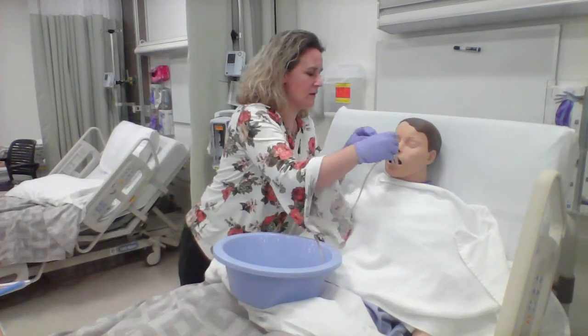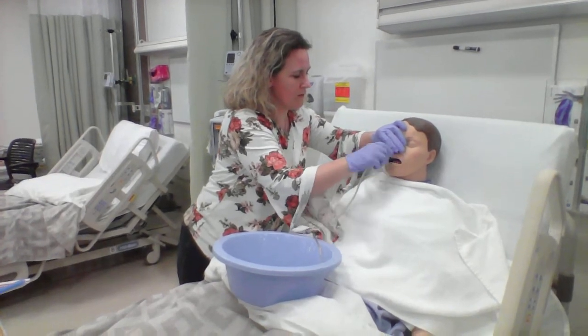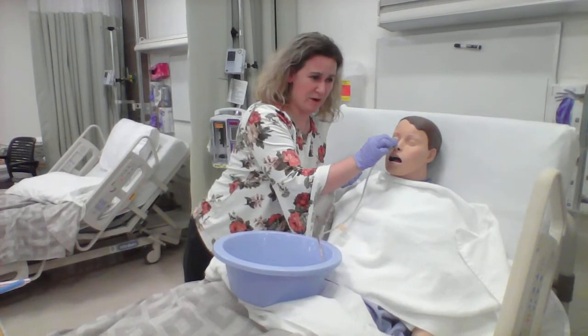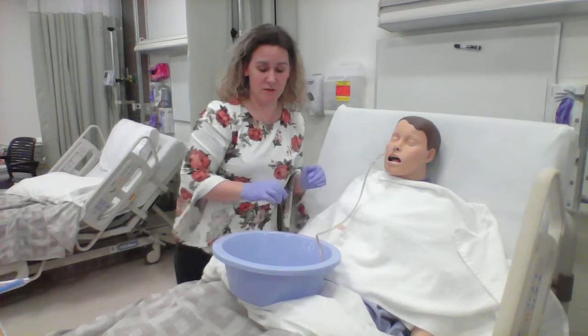So quickly, as I walk in, I'm going to make sure your bed is locked. Bed is in the lowest position. And so it's temporarily secured. At this point, we're going to mark it with a pen to make sure it doesn't slide out.